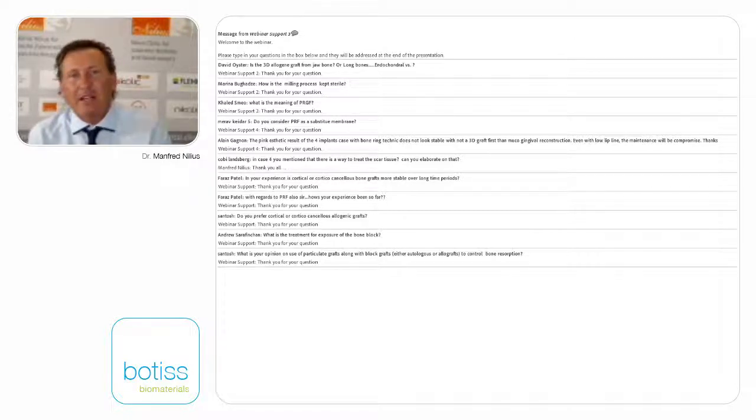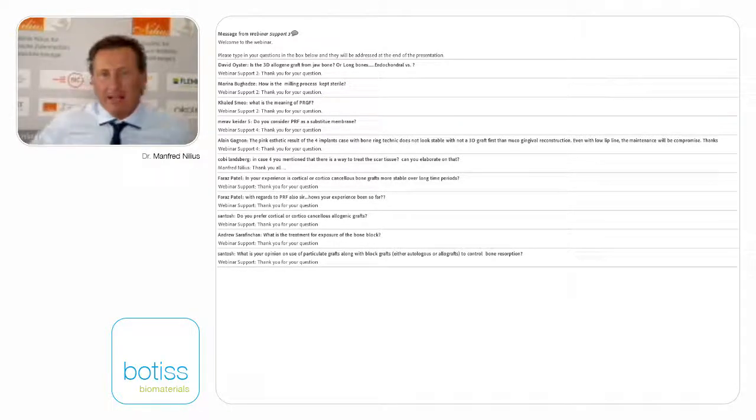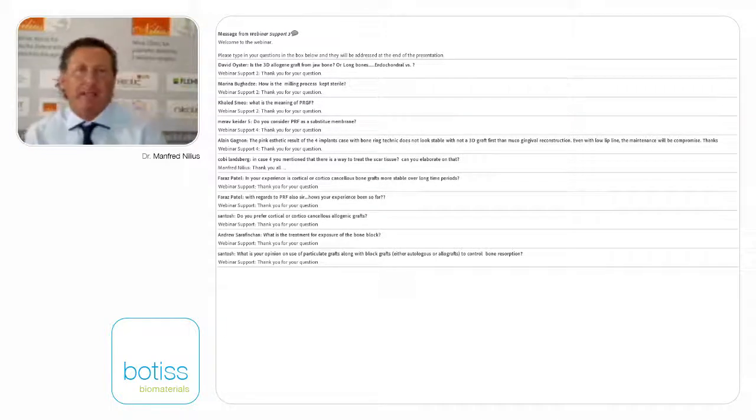There are 2 blocks I had to remove because they were exposed and they were infected. And it's very bad for the nose, even for the patient. So the faster you remove it, the better it is for the patient. And say, look, the soft tissue is not that good. Maybe it's a possibility for distraction osteogenesis, or make a sinus lifting when it is a posterior part. So there are different other ways you have to explain to the patients. Never lie, tell the truth.